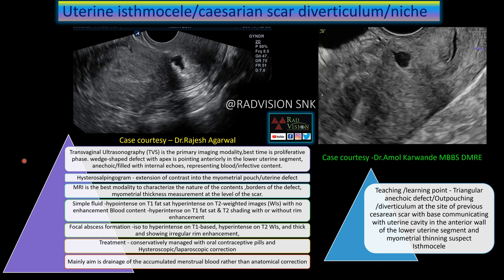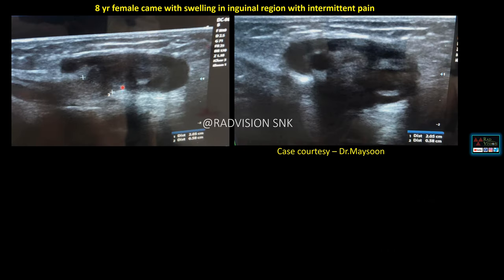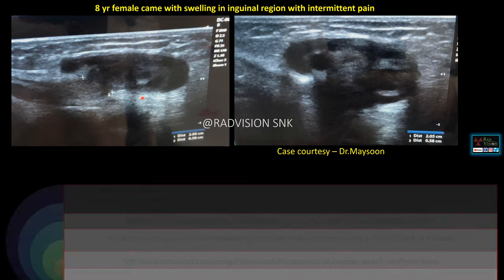Next case: an 8-year-old female presented with swelling in the inguinal region with intermittent pain. You can see a soft tissue lesion typically showing follicle-like structures, closely communicating with a canal, which in turn communicates with the peritoneal cavity. Whenever you see an ovary-like structure in the inguinal region close to the labia, communicating with a canal that directly connects with the peritoneal cavity, definitely suspect Canal of Nuck hernia.